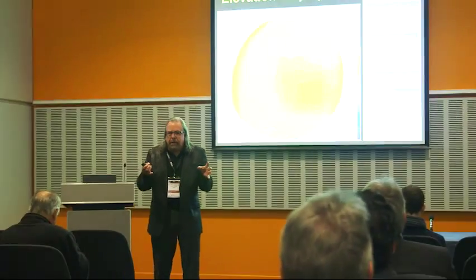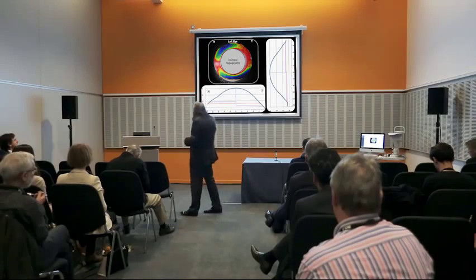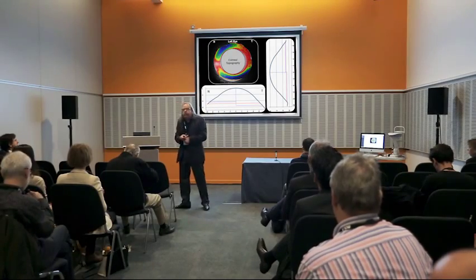But for many of us, especially those of us involved in scleral lenses, where we have directed most of our research is not in the cornea, but really in the shape of the sclera. What we as clinicians need to find out is the symmetry of the sclera.